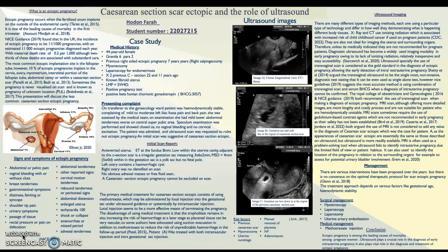According to the Royal College of Obstetricians and Gynaecologists 2015, 3D ultrasound takes longer to perform, therefore is associated with higher power output than that of 2D, which is not in accordance with the ALARA principle. Furthermore, Looney et al. 2021 state the use of 3D in early pregnancy is not recommended as a standalone clinical tool and does not replace 2D ultrasound.